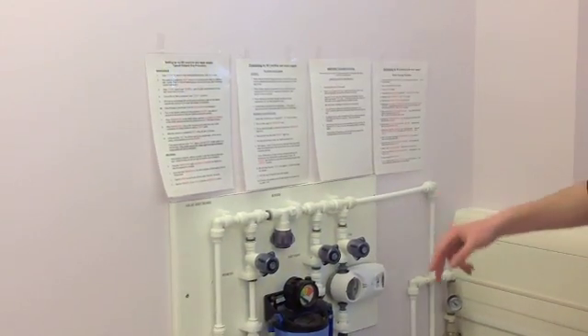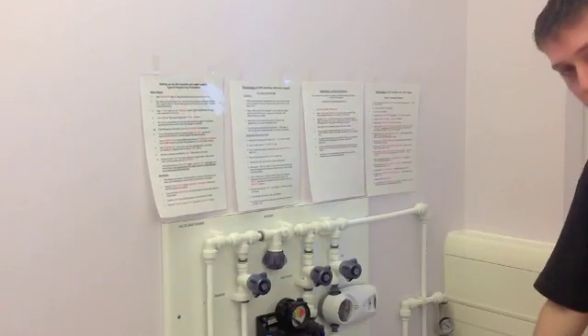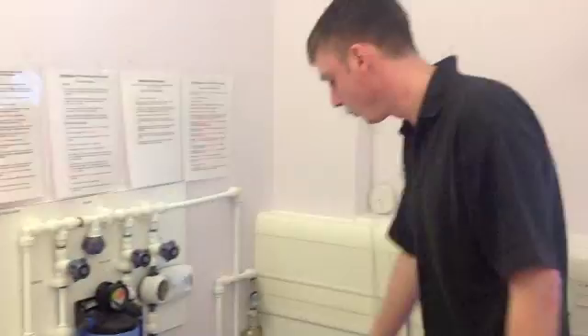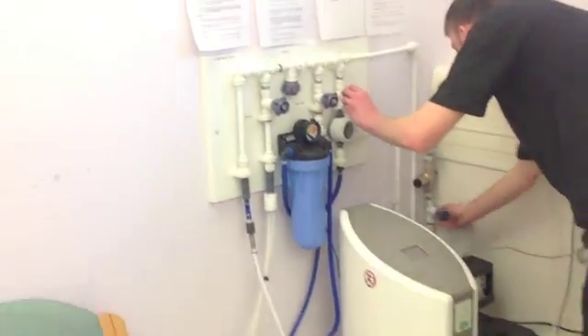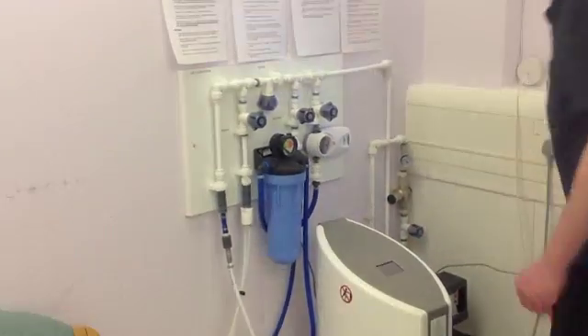If you lose it at any point, don't worry — you can contact us and we will give you another one. And the RO itself will also come up with the step by step instructions. After you have done all of this, make sure that you do turn it off. Turn off your water at every point just so that you don't get any leaks.